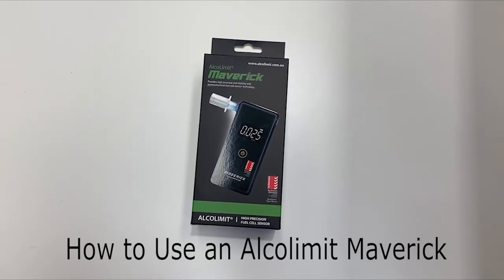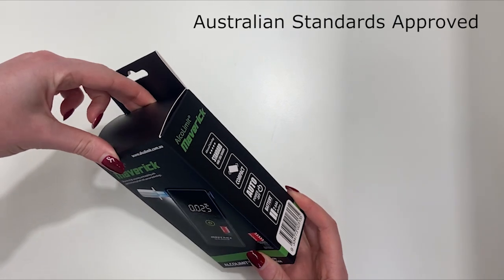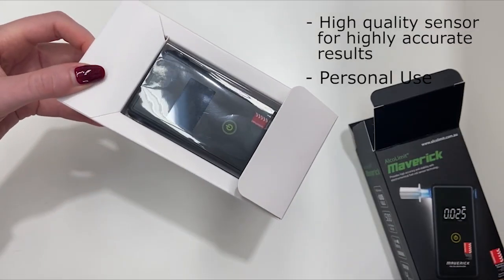How to use the Alkalymic Maverick. The Alkalymic Maverick is Australian standards approved. It provides high accuracy and is suitable for personal use.